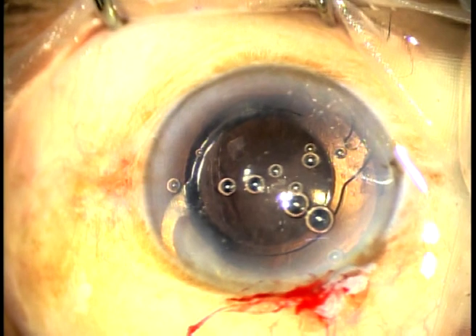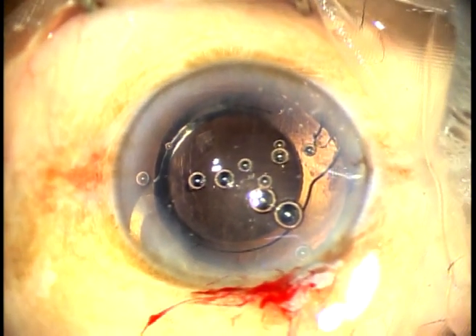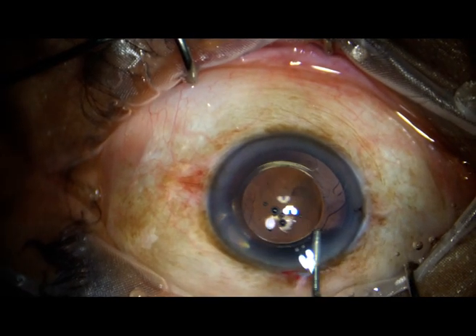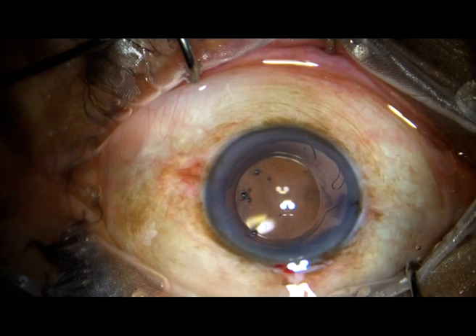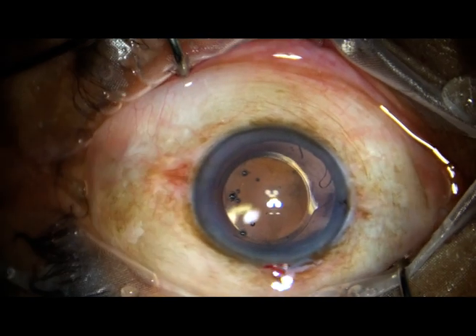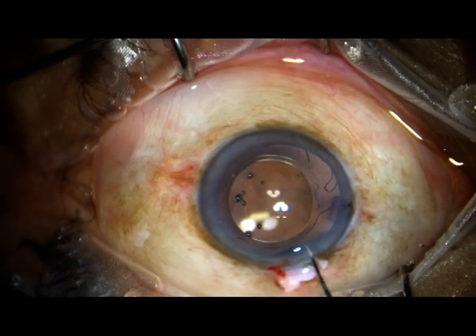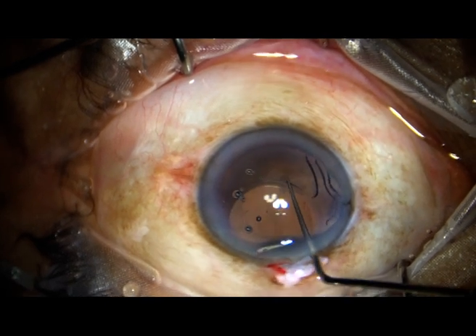I shifted the patient to the next OT where the vitrectomy setup was ready. Injected visco, took a Sinskey hook, and placed the IOL in the sulcus.